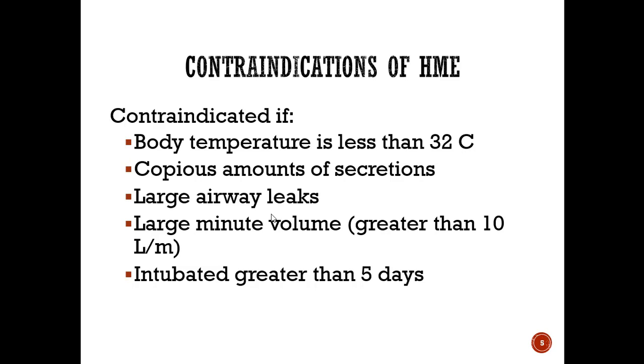And then if they're intubated longer than 5 days, when you start to have these longer periods of intubation, you start to require a little bit of extra help with that heat and humidity because ultimately it's not a natural thing. It's not physiologically normal to have your upper airway bypassed for that long. So we want to make sure that we're providing a higher level of humidity output just to prevent any damage to the lungs.